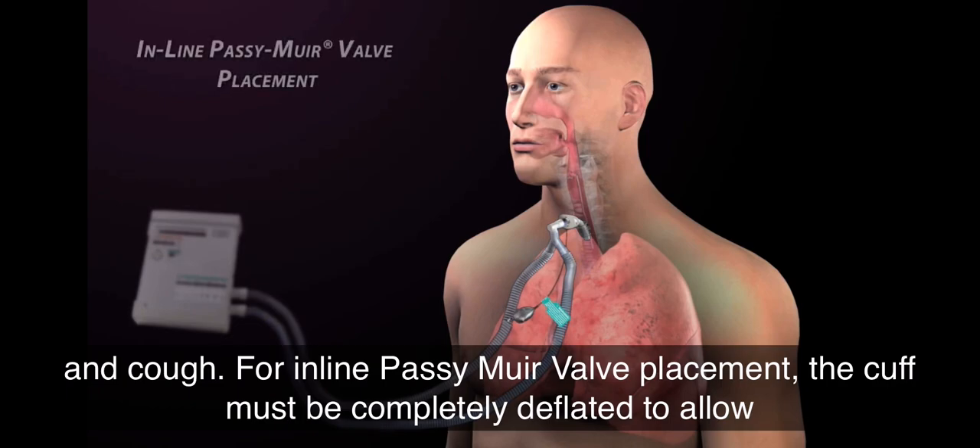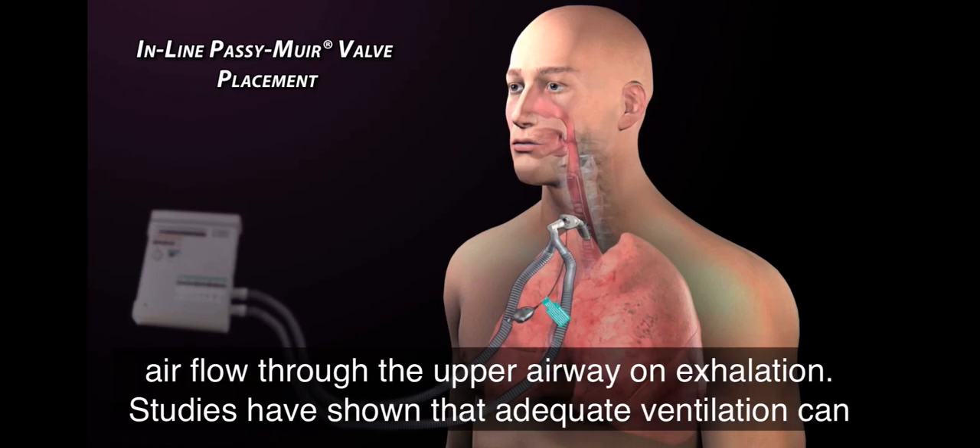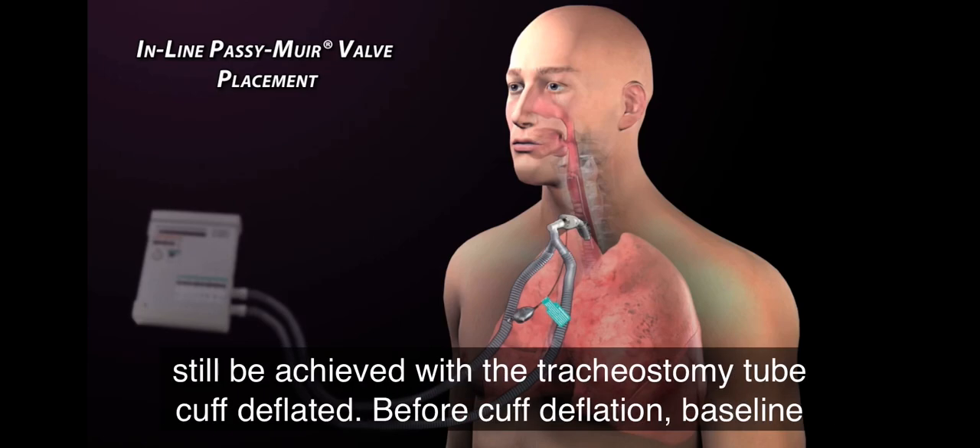For inline Passy Muir valve placement, the cuff must be completely deflated to allow airflow through the upper airway on exhalation. Studies have shown that adequate ventilation can still be achieved with the tracheostomy tube cuff deflated.